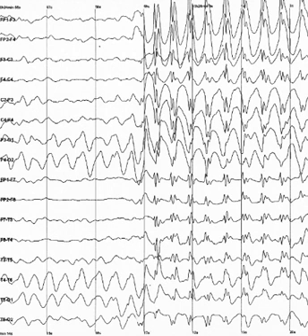ECG artifacts are quite common and can be mistaken for spike activity. Because of this, modern EEG acquisition commonly includes a one-channel ECG from the extremities. This also allows the EEG to identify cardiac arrhythmias that are an important differential diagnosis to syncope or other episodic attack disorders.